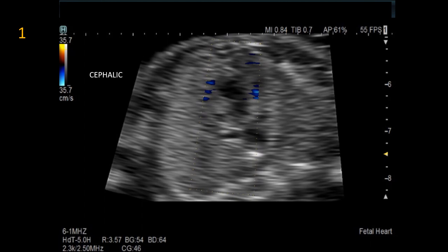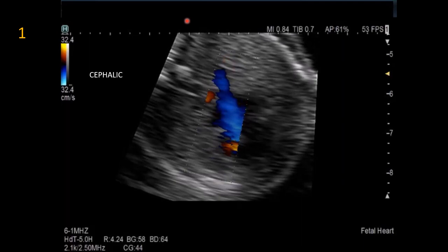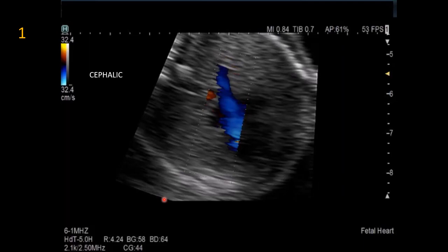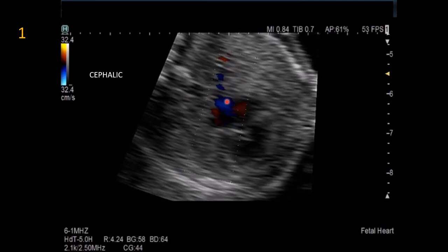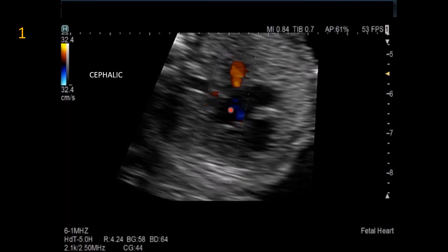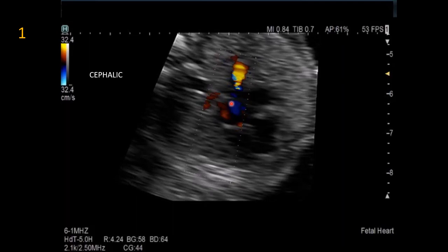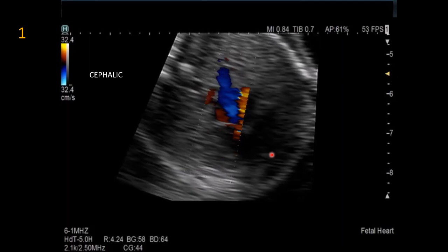With color Doppler, retrograde flow is seen in what is likely the ductus arteriosus on the underside of the aorta, with antegrade flow through the main outflow tract. The SVCs draining to the atria and the left pulmonary artery in systole are identified. Viewing from the back left of the fetus, direct unobstructed pulmonary venous return to the right-sided atrium is demonstrated, a notable finding in this right atrial isomerism case.